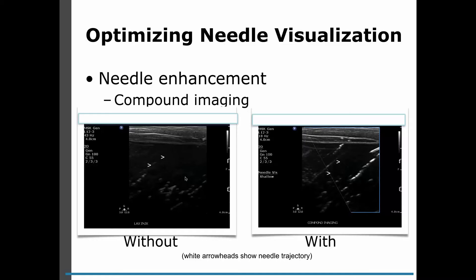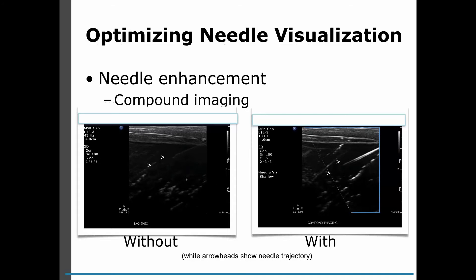The screen on the left shows an injection using standard ultrasound imaging. However, the screen on the right shows what that same injection looks like using compound imaging. You'll notice that the needle on the right is much brighter, much more hyperechoic and easier to see.